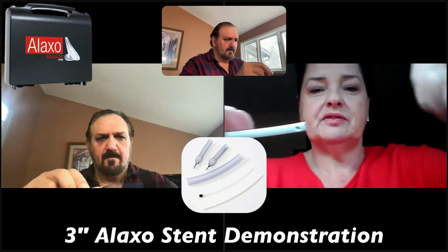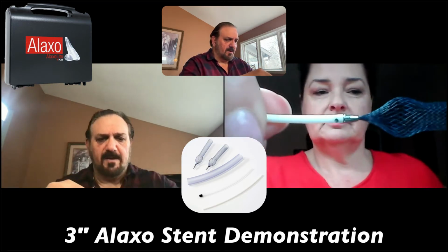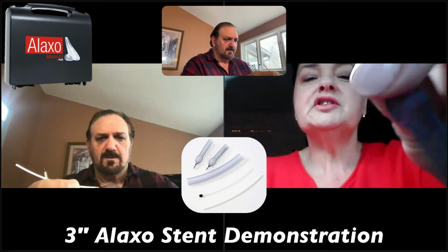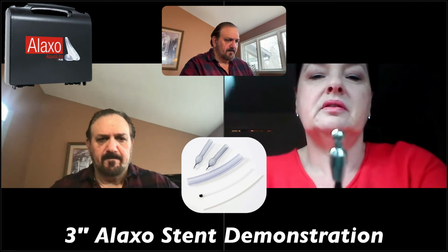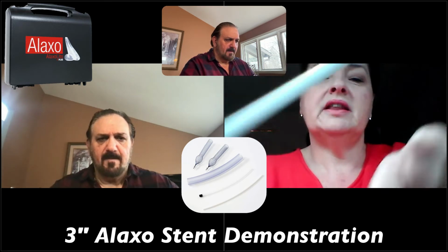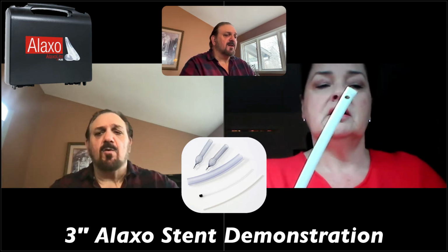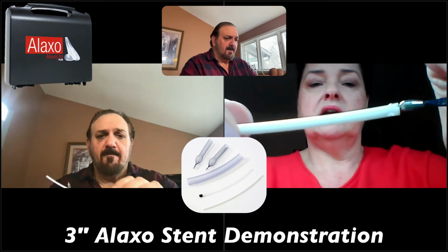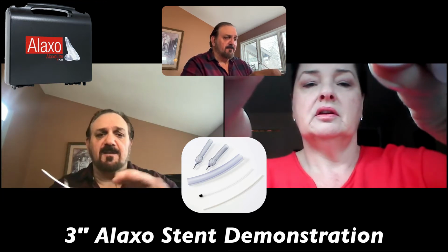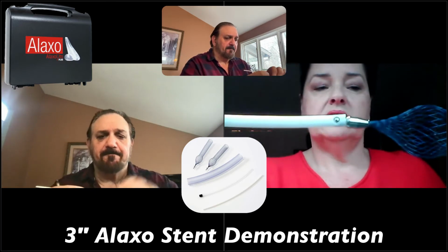So you just pop the silver thing in. Right. So I'm just looking to see. I don't quite see what goes into the holes. Nothing goes into the hole. See this little part of your stent, the little round silver ball here? At the end of the pusher rod, there's holes in there. Do you see that? The holes are there to indicate which side you put it on, and it's also going to secure it. Install it in the end, and then it's going to secure it. Great, I got it.